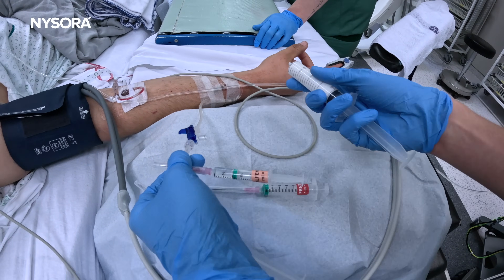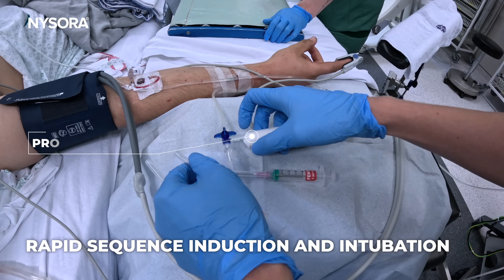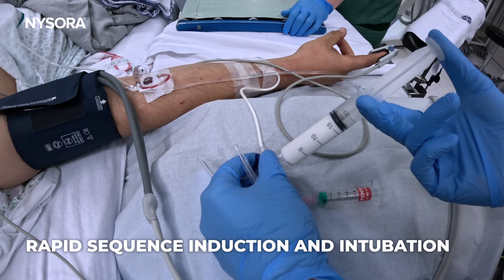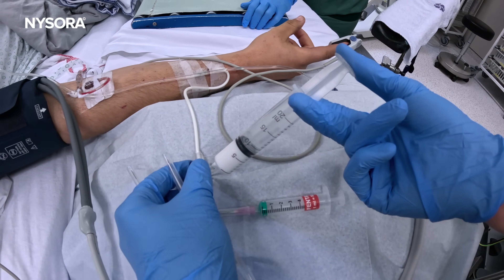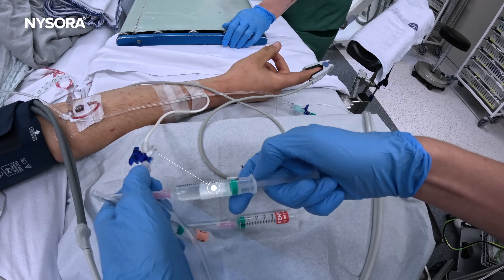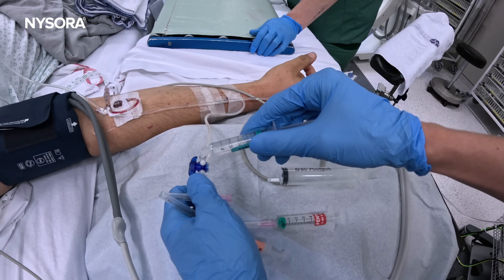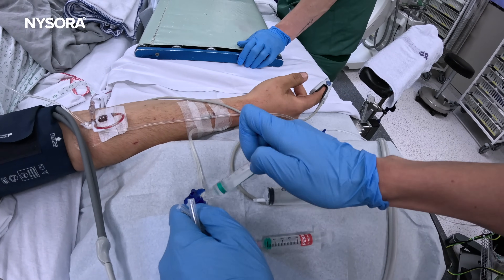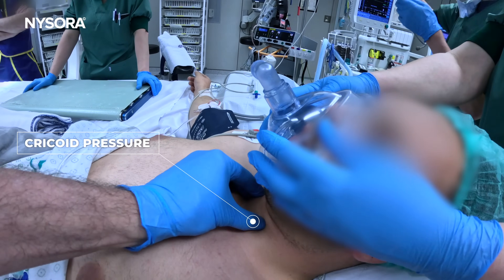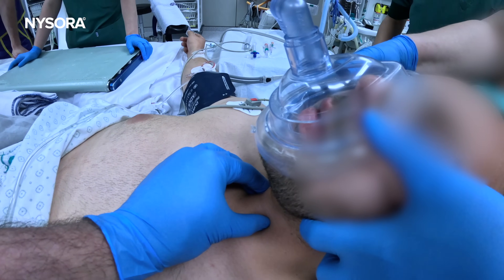So we're going to start with induction: 200 milligrams of propofol immediately followed by muscle relaxant for a modified rapid-sequence intubation for gastric content aspiration protection. You want this to go in as soon as possible, as fast as possible. And we're going to flush that with rocuronium. As soon as that goes in, we're going to use slight cricoid pressure, and probably an oral airway if necessary, if ventilation proves to be difficult.